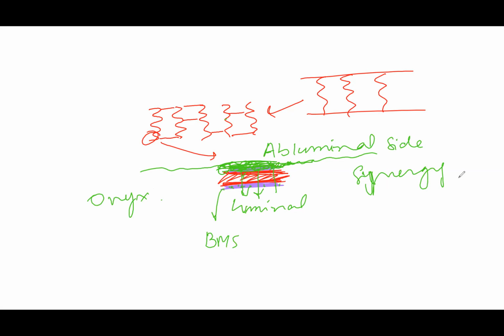The strut thickness, and I'll show you the strut thickness of different stents on one of the tables, is what causes problems. If this is the strut, I'm doing another cross section now, cutting it like this. And this is the coronary artery.